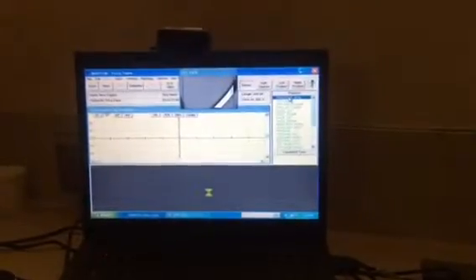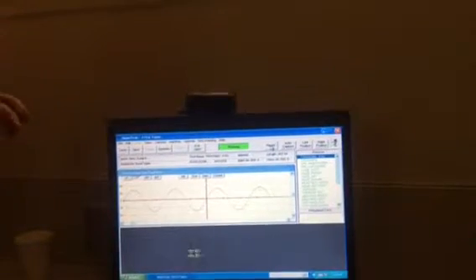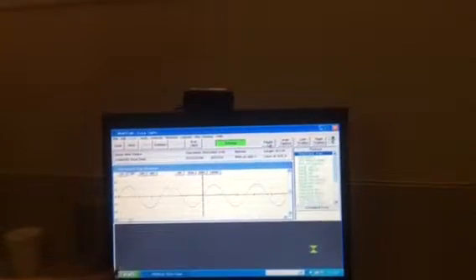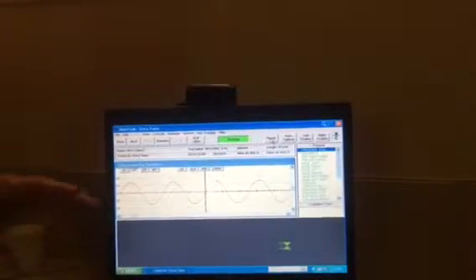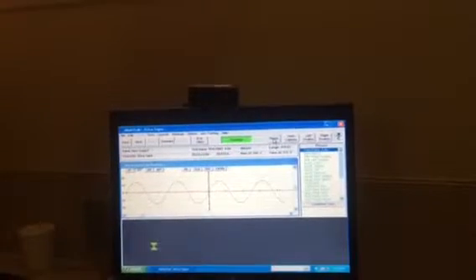I'm going to tell you in 2 minutes how to do this test. You double-click your top test, and you're going to watch and make sure that the red lines and the black lines are close together. If they are close enough together, your patient is close enough to the computer. If the red line is too far from the black line, which is your computer, that means your patient is too far. Bring them forward.